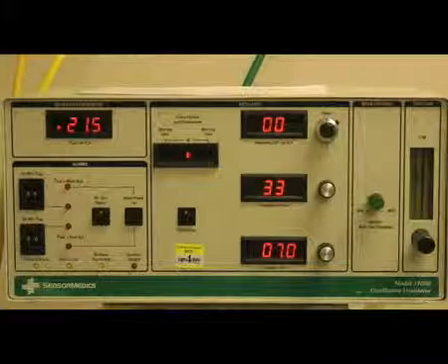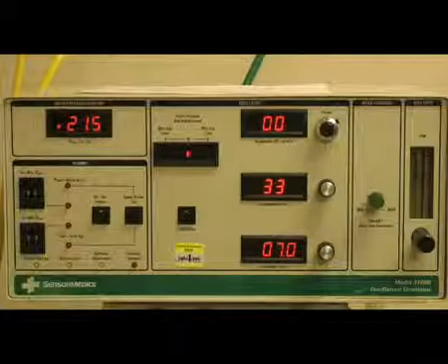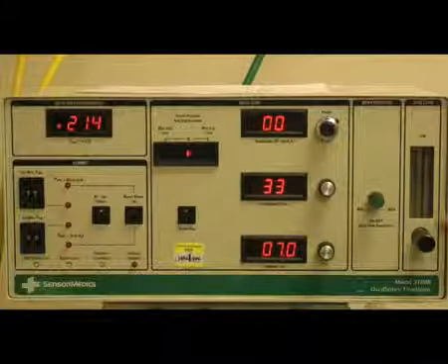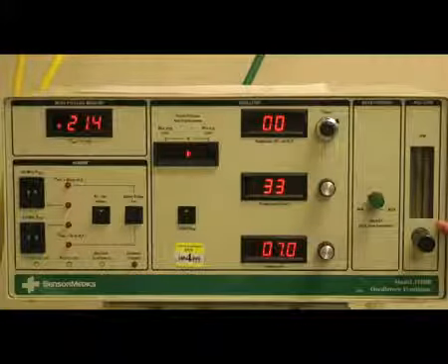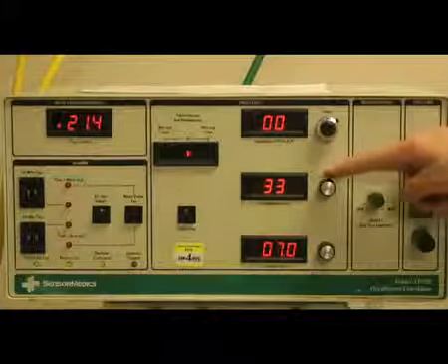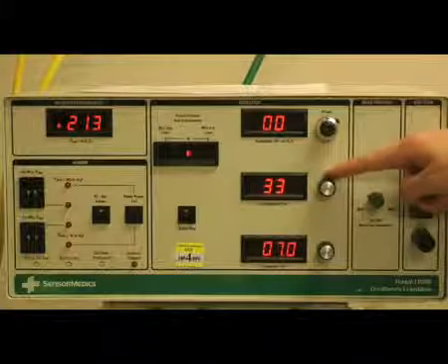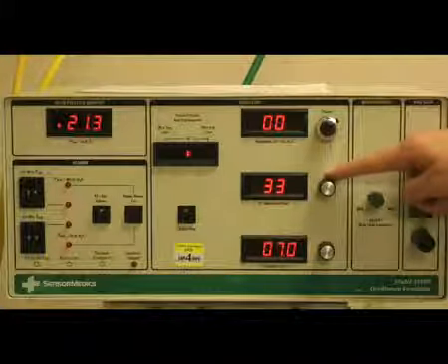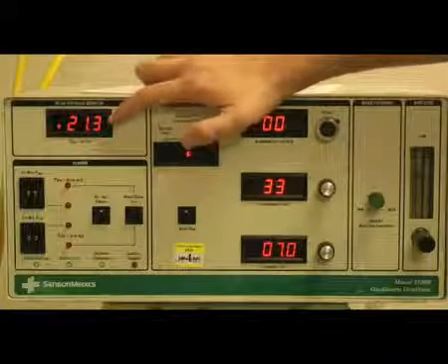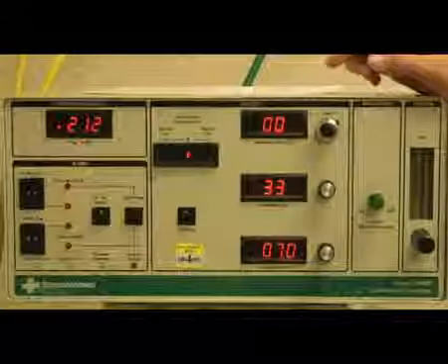Once you deem a patient appropriate for high-frequency ventilation, you must be able to set up the initial settings. To begin, you'll want to set a bias flow of 40 liters per minute. Once this is set, you want to set your I time of 33%, which will avoid a 1-to-1 IE ratio. You'll also want to start with a mean airway pressure of 34 centimeters of water pressure and an FiO2 of 1.0.